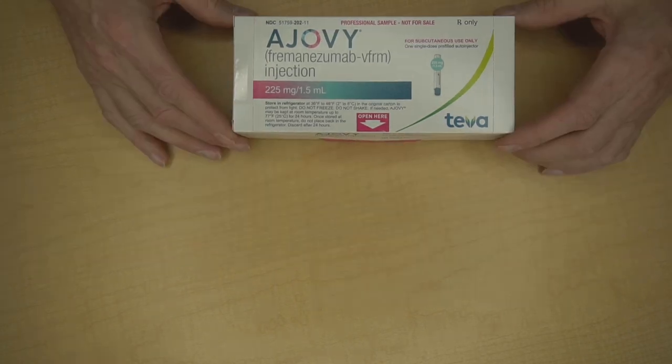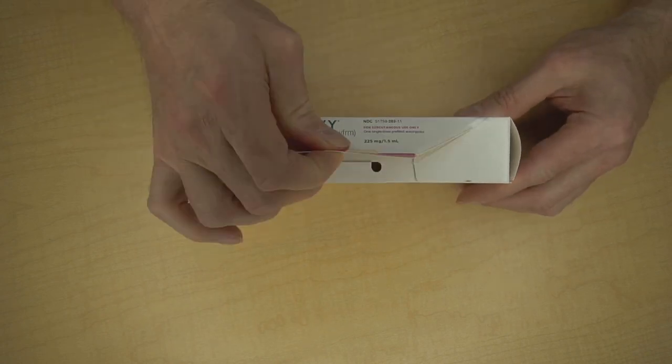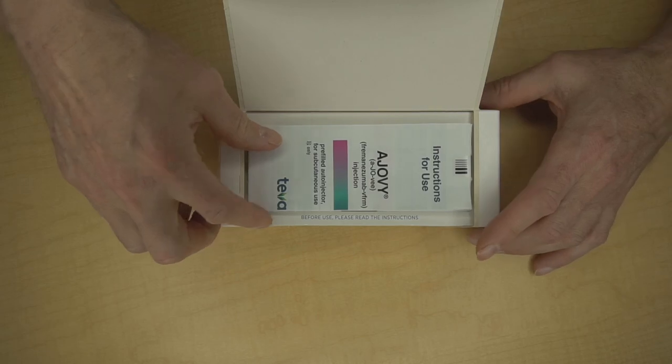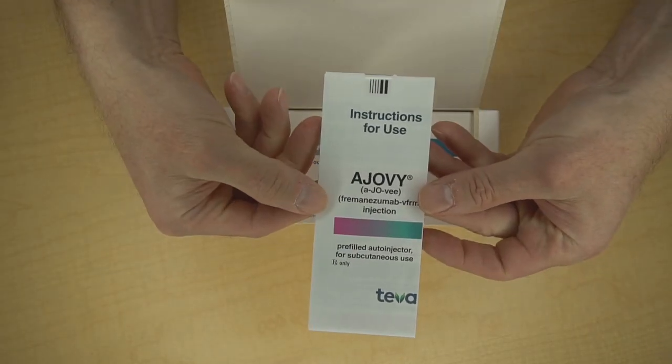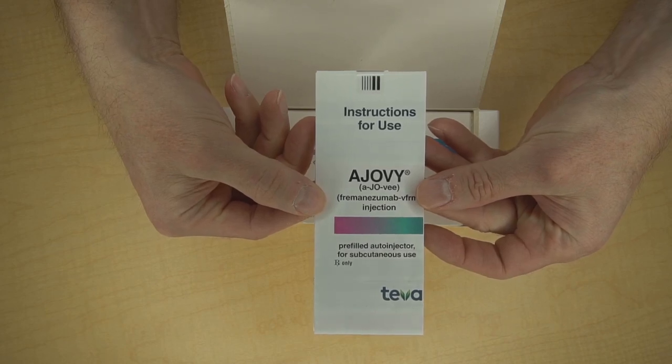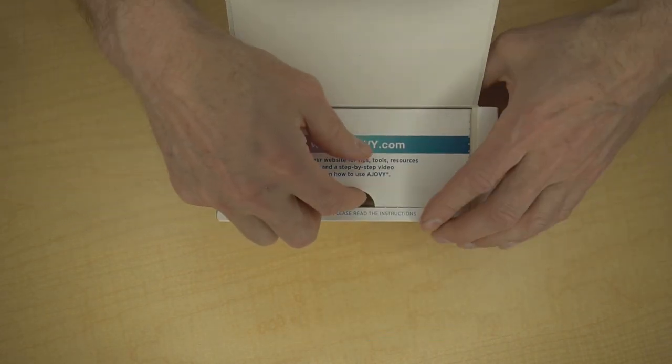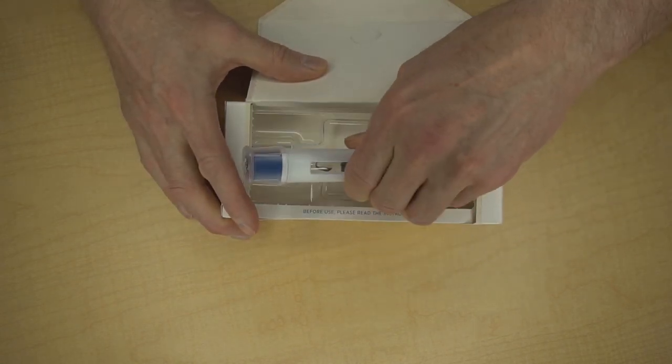To open the box, just follow the open here instructions. Lift here, tearing the box open just like that. The first thing you'll see is the instructions for use, which you should review before each injection. You can also review these instructions on the Ajovi.com website. In here, you'll find the Ajovi auto-injector. To remove it, just pull it straight out of the box.